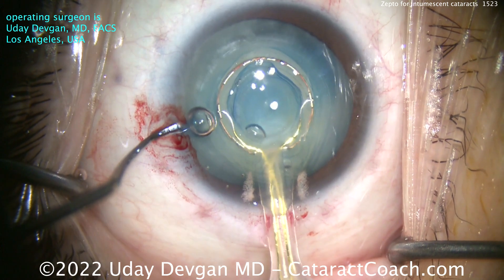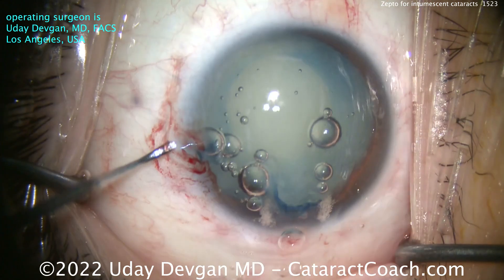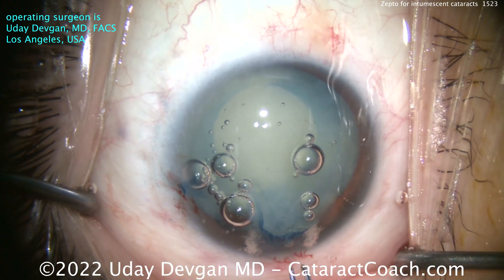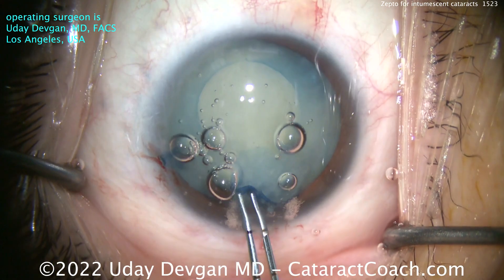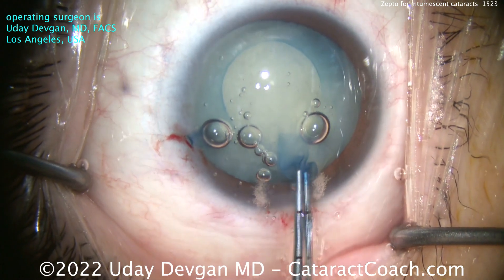Four milliseconds. And look what you get — a beautiful rhexis. It happens so fast that there's no chance for any of the liquefied lens cortex to run out. There's no chance for an Argentinian flag sign. It just doesn't happen, and the capsule is completely free-floating with no attachments left.